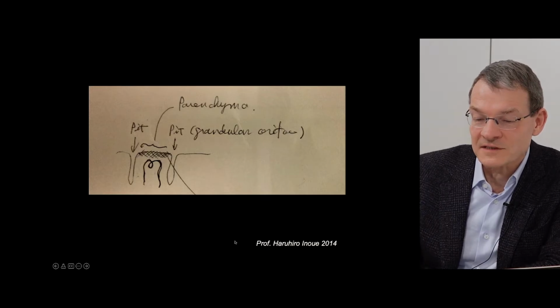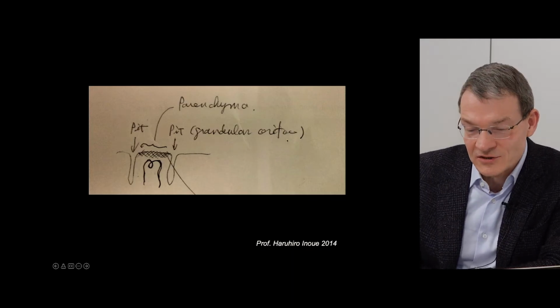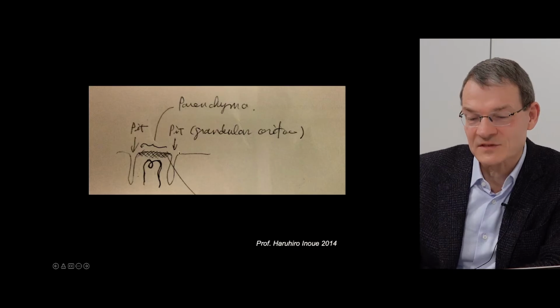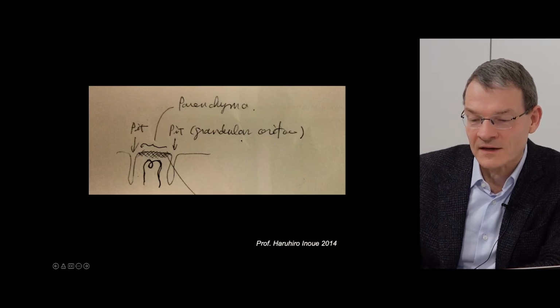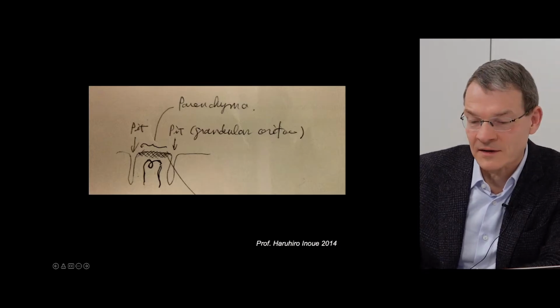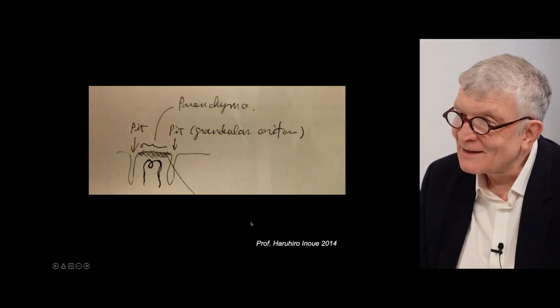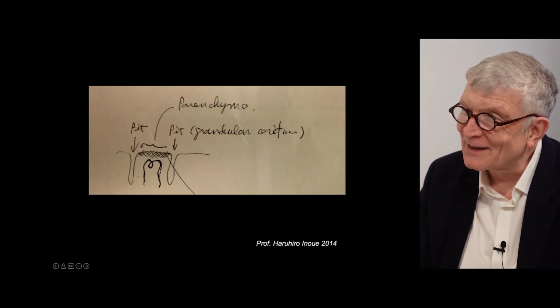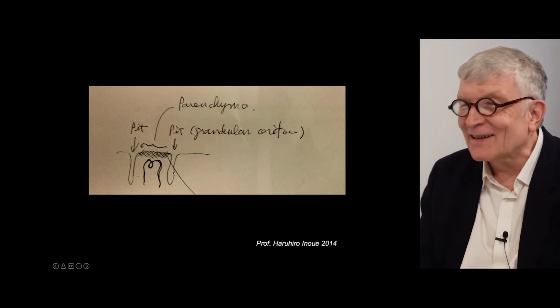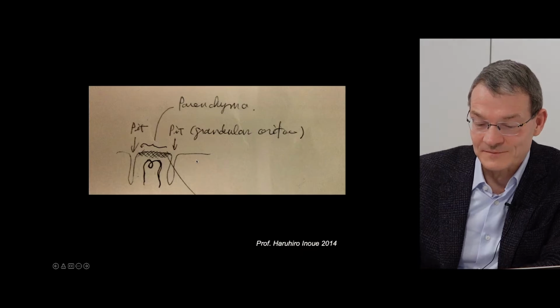So we first may on the one hand focus on the glandular structures, on the pits. So we see the opening of the glandulars. These are the typical pits, and then we have the parenchyma, and in the parenchyma we can visualize the vessels. That's a drawing from the master. Exactly. So it's worth a lot of money, probably. Yes, that's why I use this. But I think it's understandable where we have to focus on.